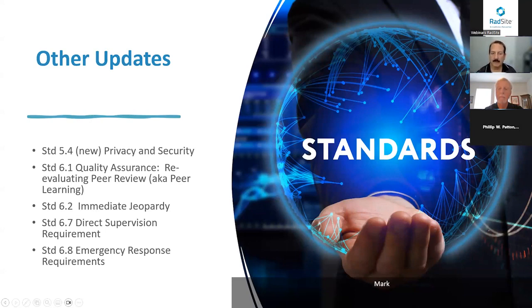And so I think on a lot of the general acquisitions, age and maybe slice thickness or number of slices and field strength is not that important. It's just the quality of the images. But in the specialty ones, if you're doing cardiac scans, 64 slice, et cetera. And I know Eliot can speak more on that.